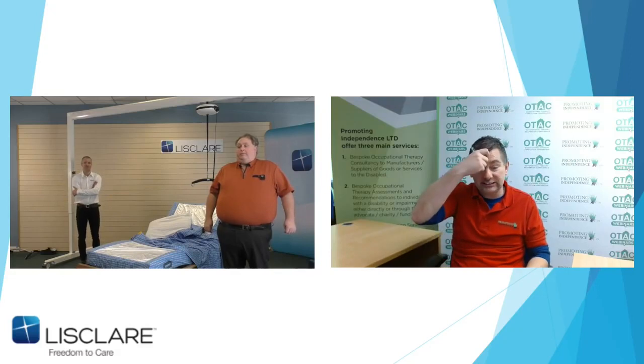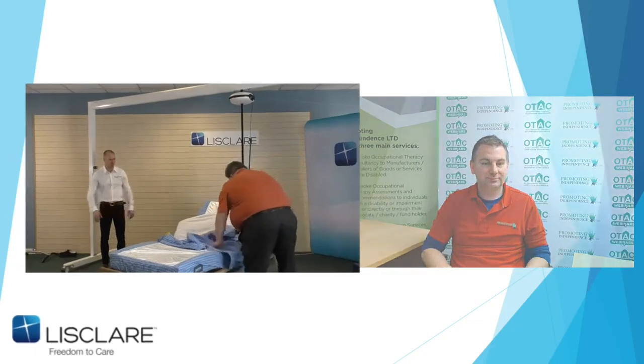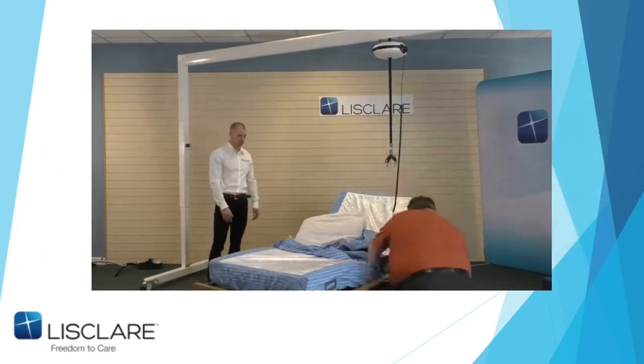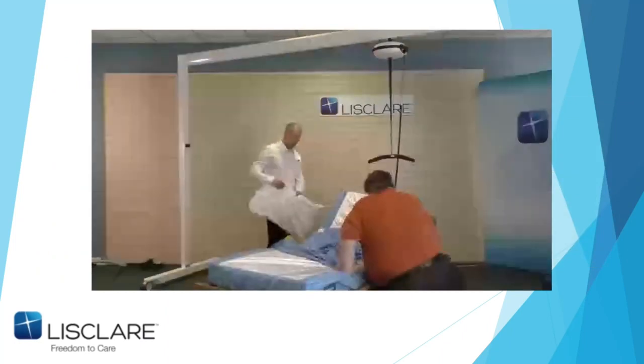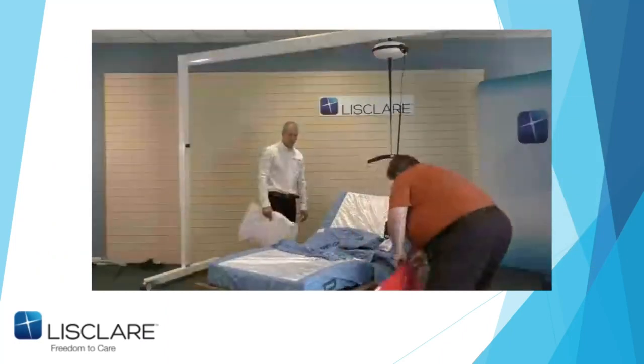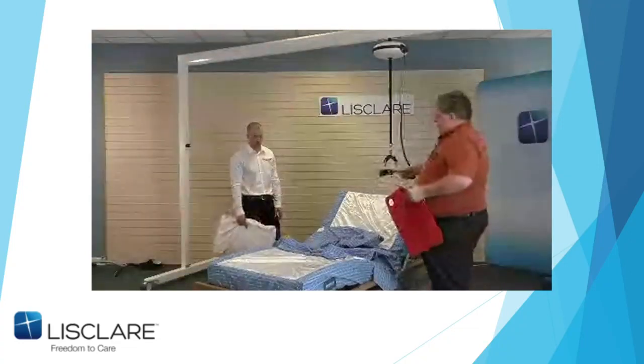Another question is, how do you get the creases out of the sheet when somebody's on the bed? Not a problem. Let me get the slide sheet. Just to show you, it's still pretty fit. Now, when a person gets onto this, they're usually hoisted onto it.